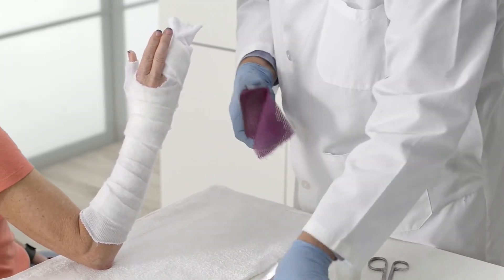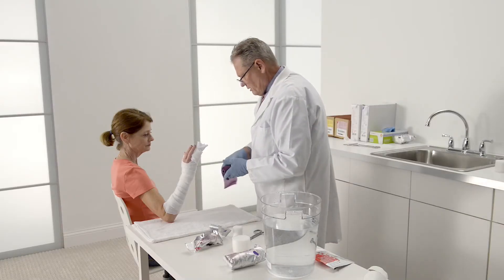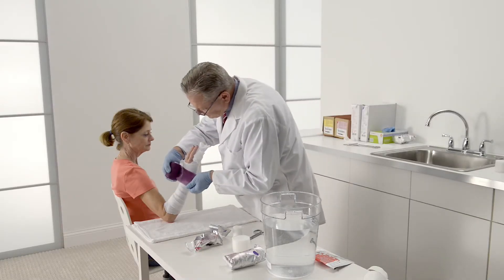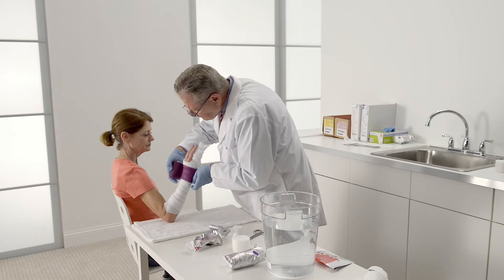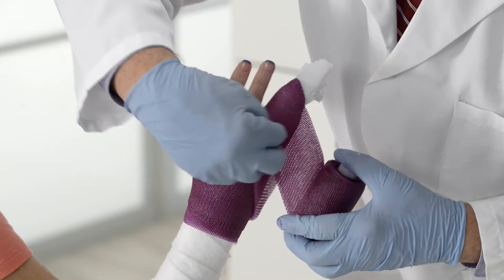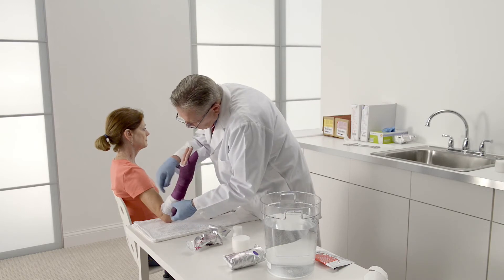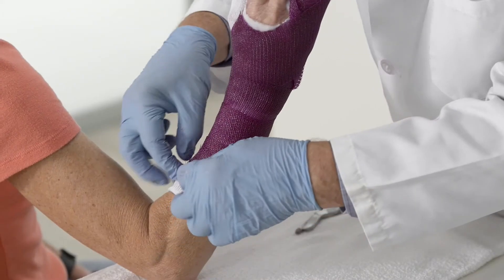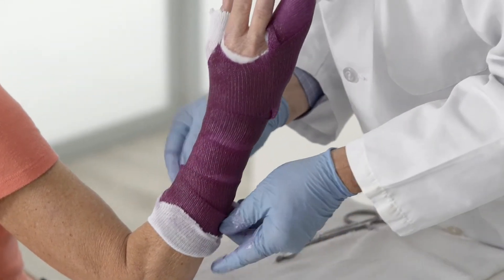Now add the first layer of soft cast. The first half of the cast will be applied without dipping the roll in water. Wrap the wrist and affected fingers. Then wrap down the arm to just below the forearm crease. Fold back the stockinette over the first layer of cast.